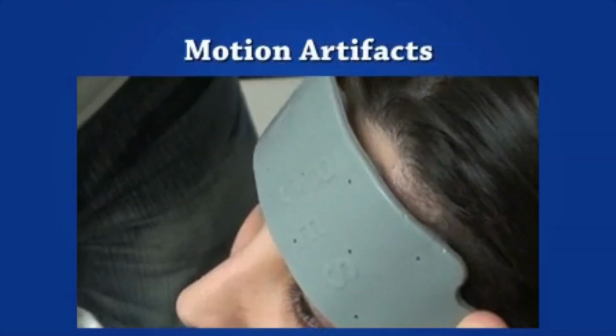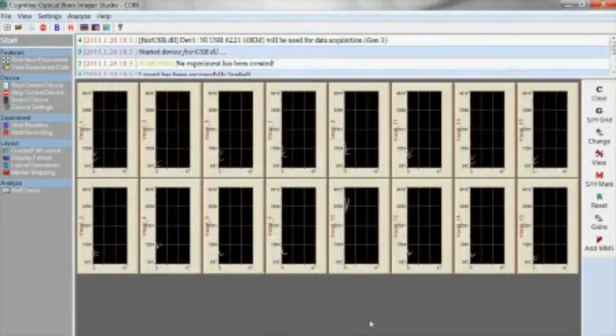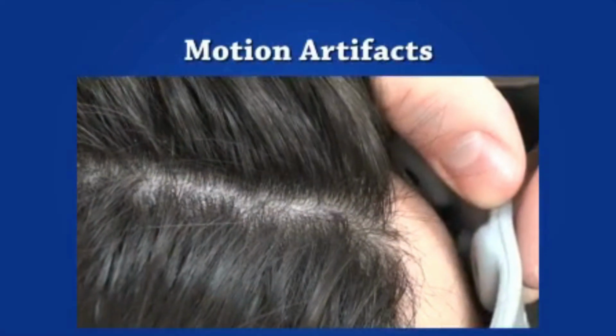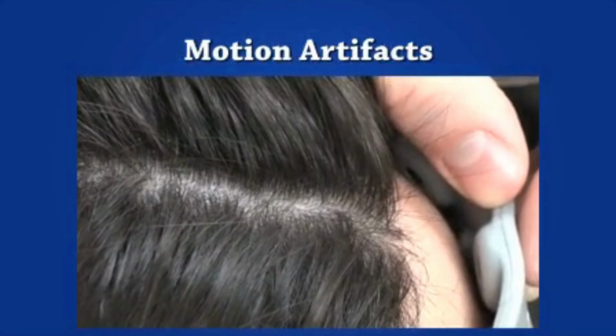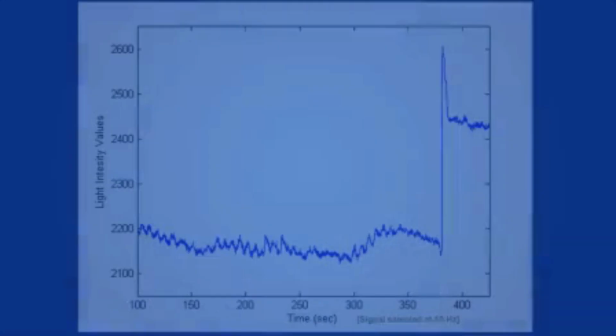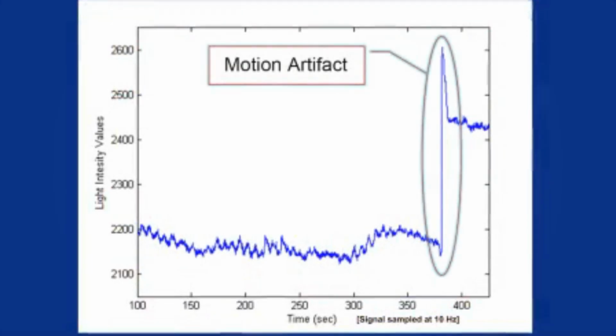Furthermore, if the light source loses coupling with the skin, the detector may record either very low values, since no light may pass towards it, or extreme high intensities and momentary saturation due to the reflected light from the surface of the skin. Similar saturation effects may happen if the detector pops and loses contact with the skin, causing ambient light to leak. Head movement can further cause changes in the pressure applied to the sensor pad or to the light sources and detectors.